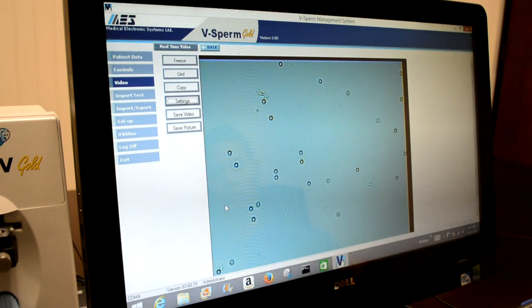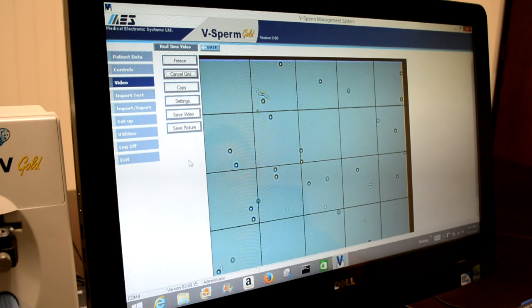We now have a handy feature available that allows you to access a counting grid. Again, everything you see on the entire screen represents 1 million per ml, but the grid can make it simpler to count.